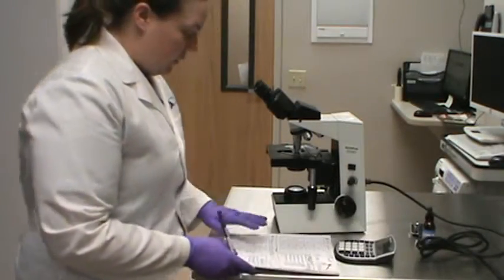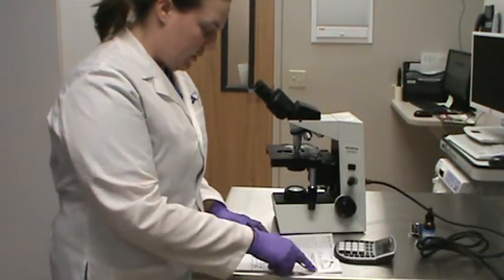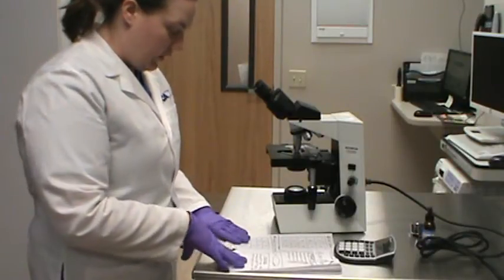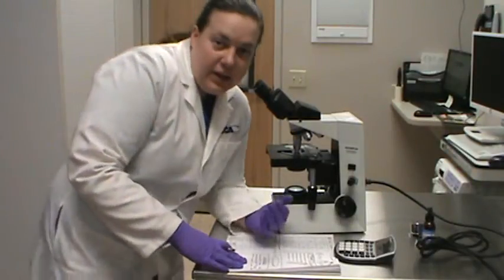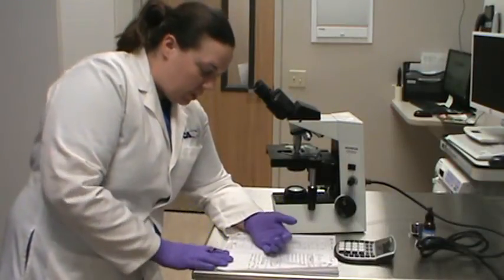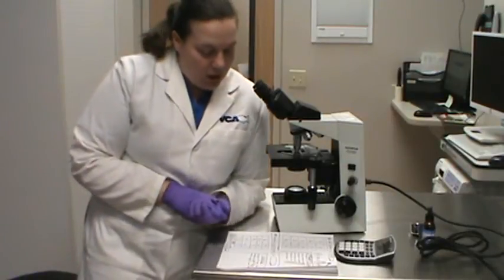Okay, so again, we went over counting 100 white blood cells and the percentages of each. We did our platelet count and we noted any morphology, which luckily for this friend doesn't seem to have any other than some crenated red blood cells. So that wraps up this portion of task 4. Just give me a moment, I'll be back and we'll continue on.